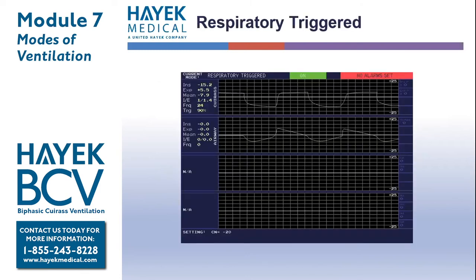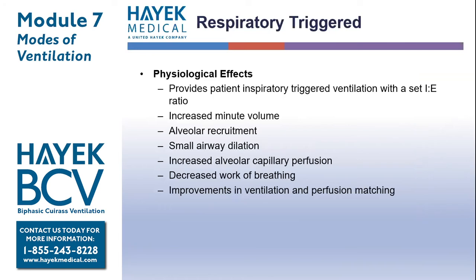Respiratory triggered mode. Physiologic effects of respiratory triggered: it provides patient inspiratory triggered ventilation with a set IE ratio. Increases minute ventilation, alveolar recruitment, small airway dilation, increases alveolar capillary perfusion, assists with decreasing work of breathing, and patients experience improvements in VQ matching.